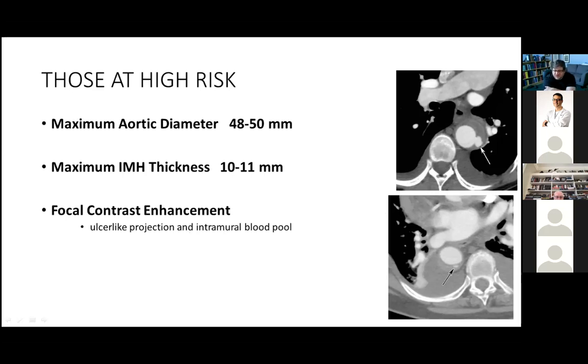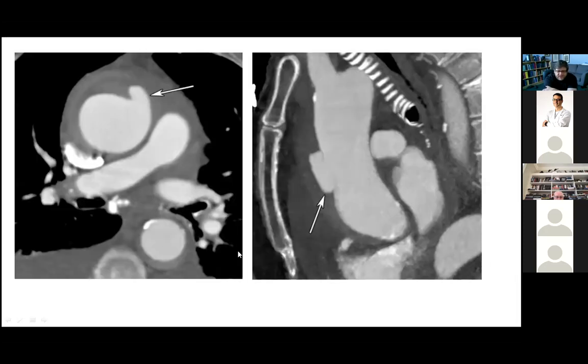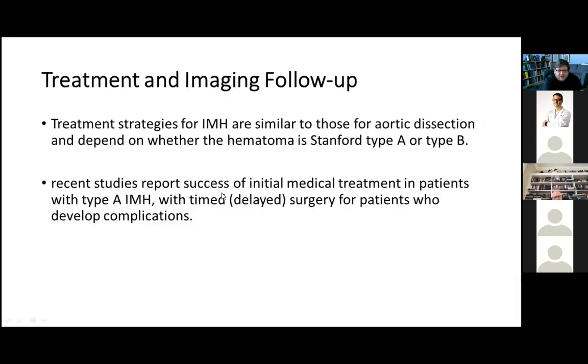And this is not uncommon to see, actually. Again, some other images portend a poor prognostic factor and would lead us to likely operate.